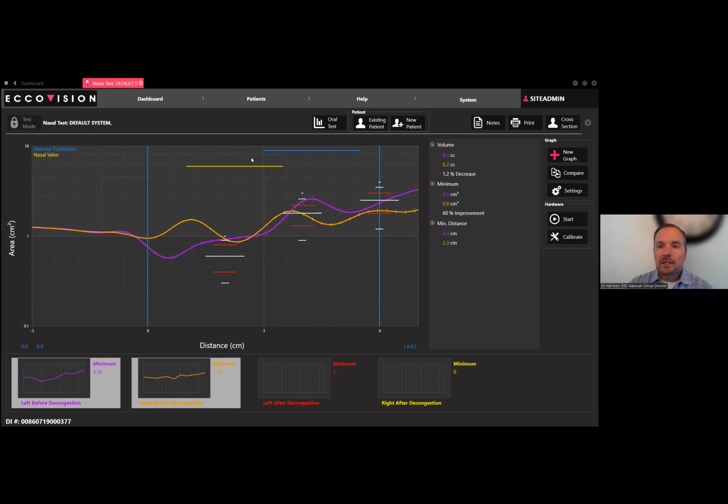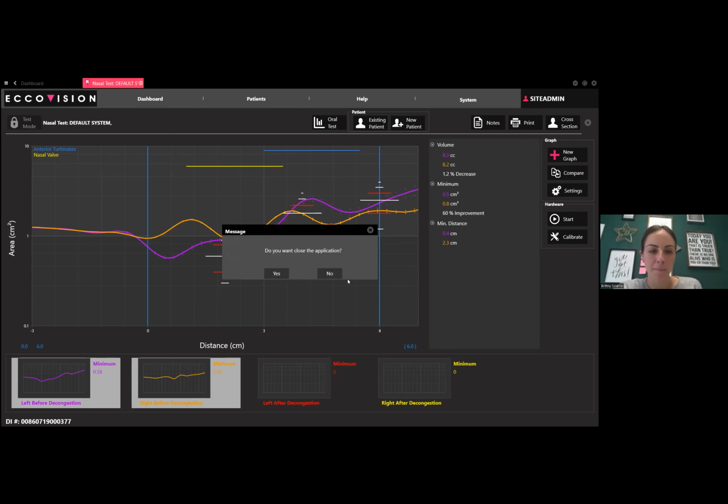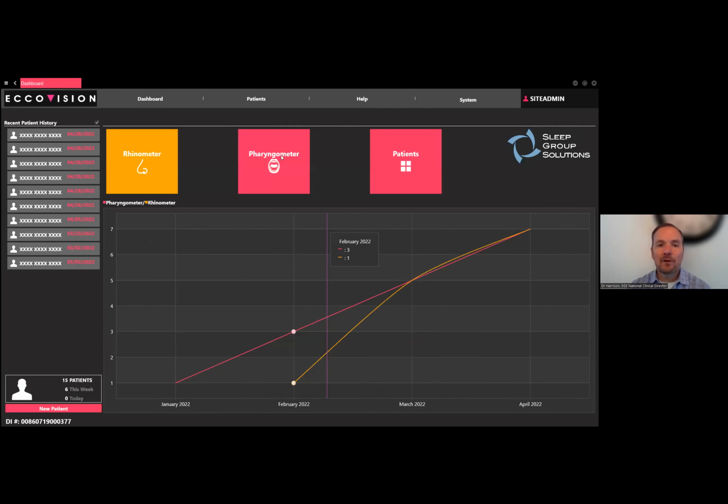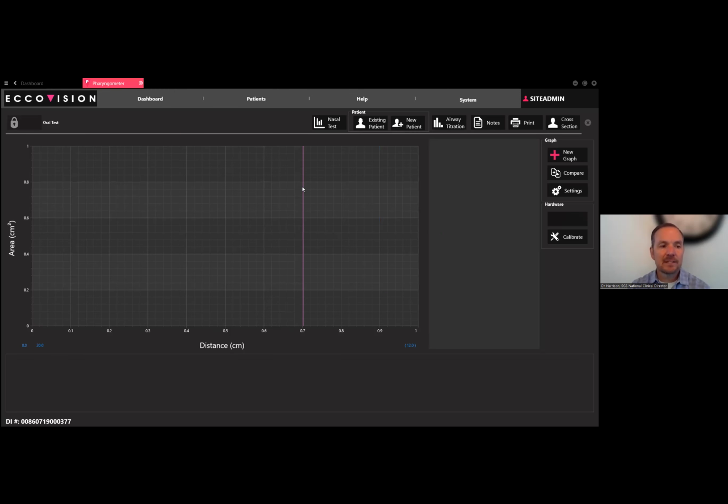All right, so let's see. Let's close rhinometry. I want to close the application. I got to move my screen. There we go. Wrong X. I'm not going to assign a patient. Now we'll go to pharyngometer. You'll hear a knocking sound. That's the calibration.